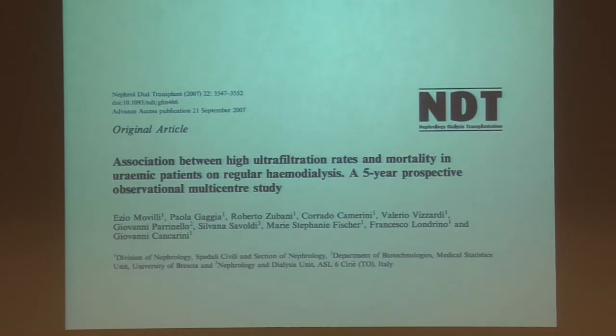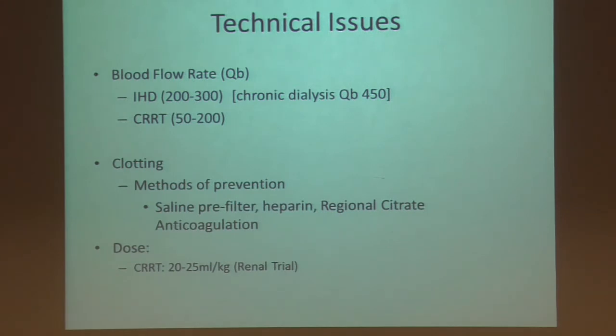So this is just the literature where we got this. They did a 5-year study on outpatient units, and the patients who had a higher UF than 13 ml per kilo, they would come in 6 liters over, and some units would just pull it. They did not do well over time. So now finally Medicare puts this as a metric that we can't remove too much fluid in a session, but I think it makes sense. I don't think we need that as a metric.